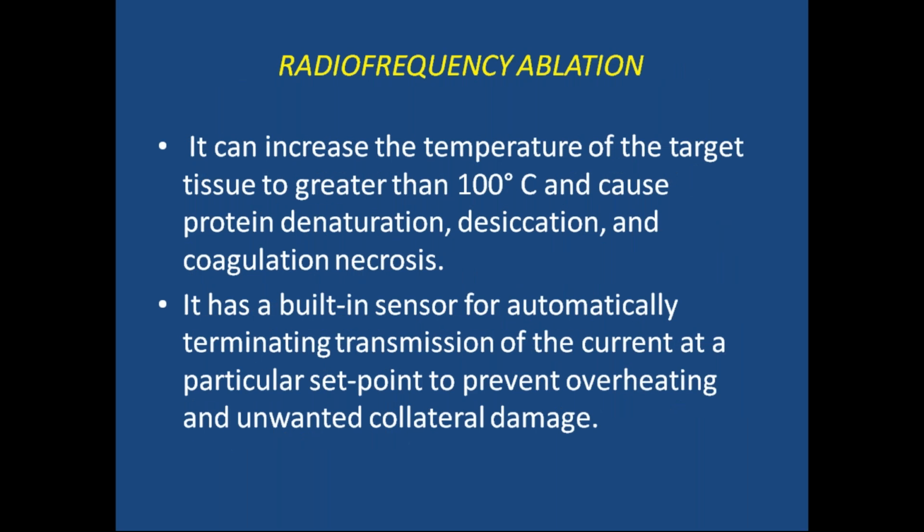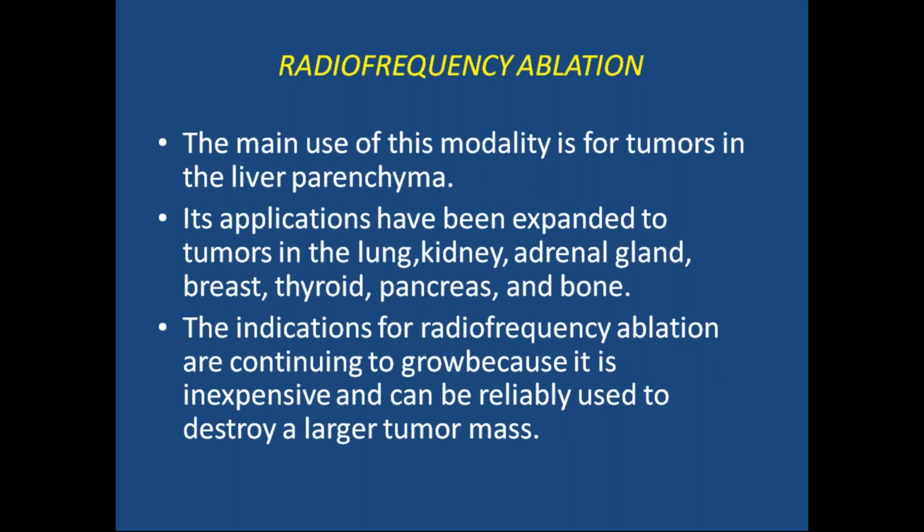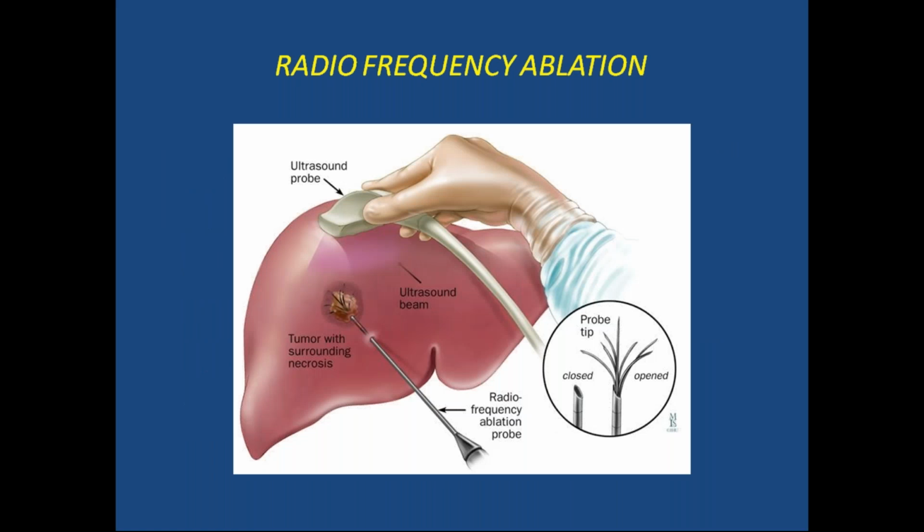Temperatures greater than 100 degrees can cause protein denaturation, desiccation, and coagulation necrosis. All of this is not important, but you have to know in brief. It is better to know in brief than to go into depth. So this is the use of radiofrequency ablation.